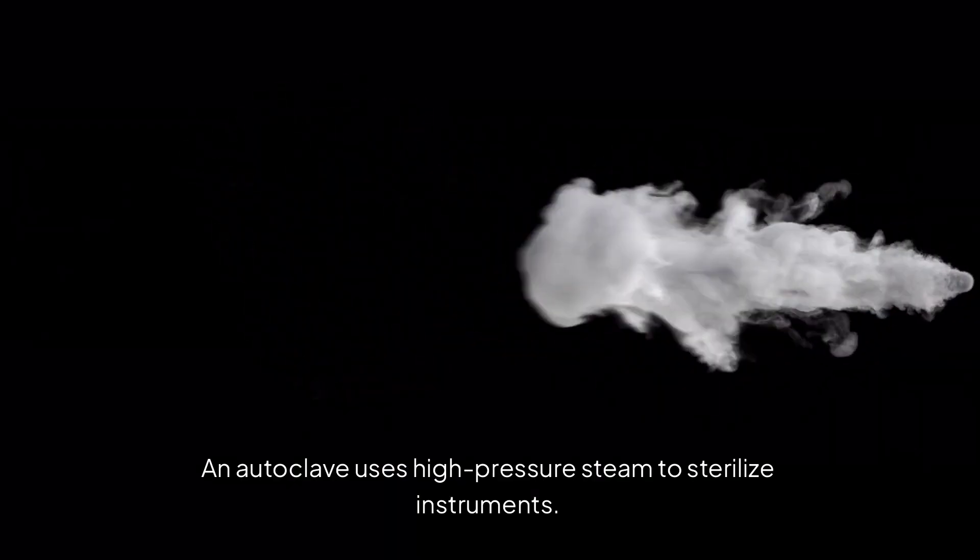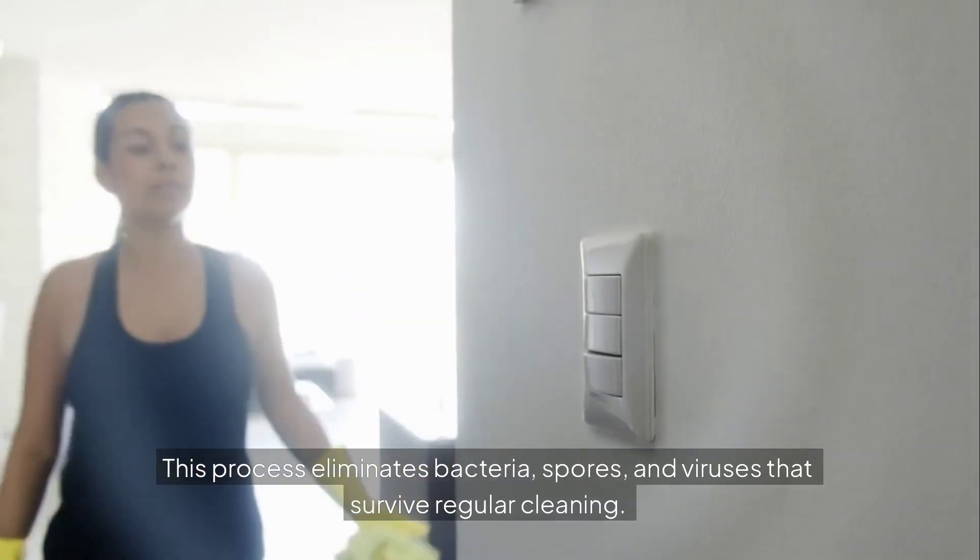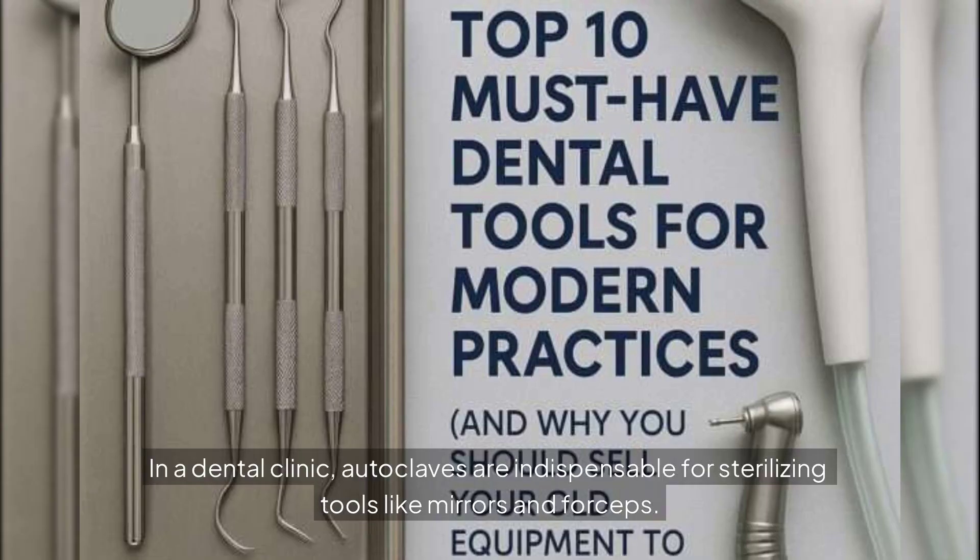An autoclave uses high-pressure steam to sterilize instruments. This process eliminates bacteria, spores, and viruses that survive regular cleaning. In a dental clinic, autoclaves are indispensable for sterilizing tools like mirrors and forceps.